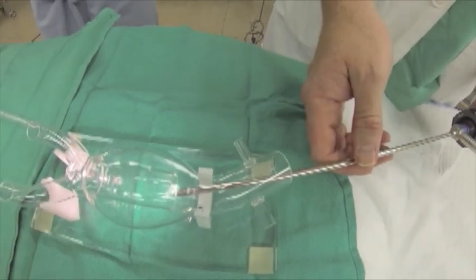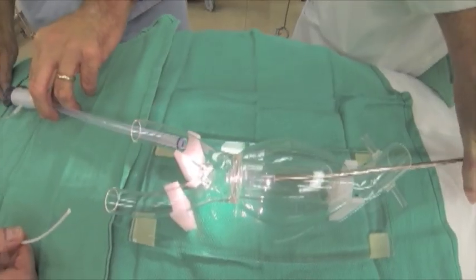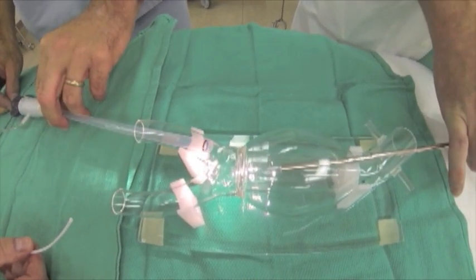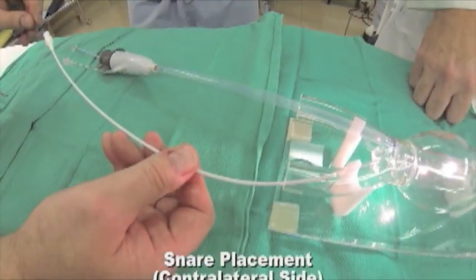This is the location of the incisions in the groin. Here's a view from the inside of the model. Then on the ipsilateral side, a sheath is placed — an internal view of what is seen on the outside.